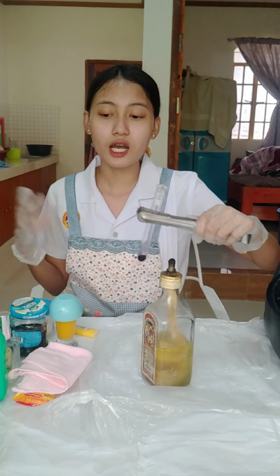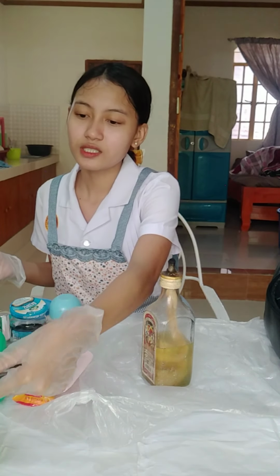If it is bluish green, it is 0.5% sugar. And then if it is yellowish green, it is 1% sugar. And then if it is orange, it is 1.5% sugar. And then if it is brick red, it is 2% or more sugar. Then I will put it on the waste receptacle.